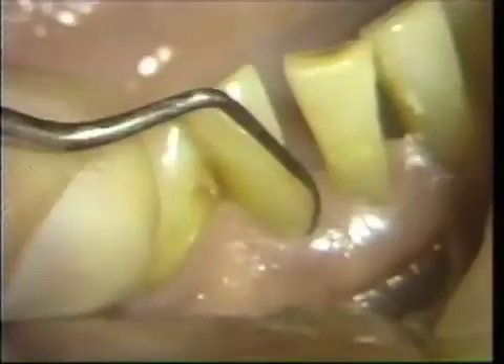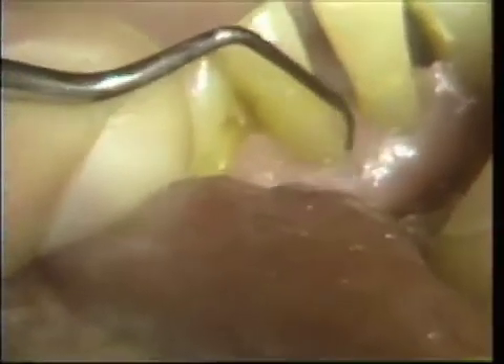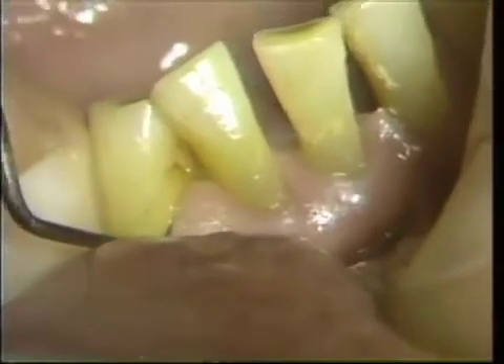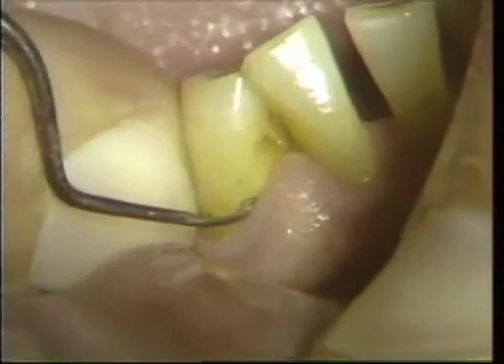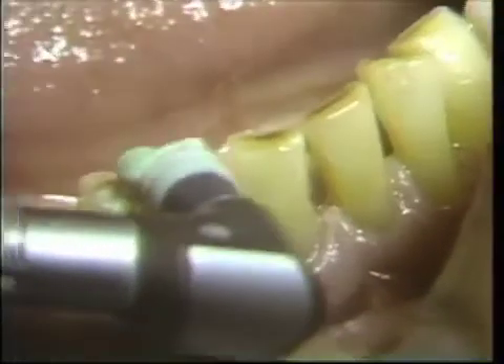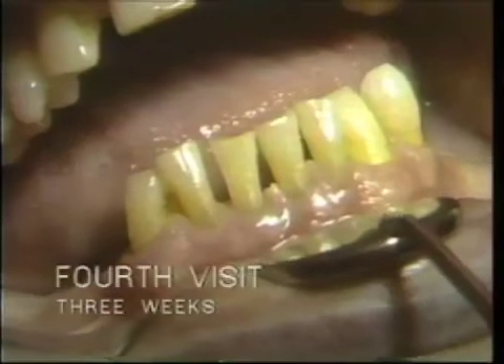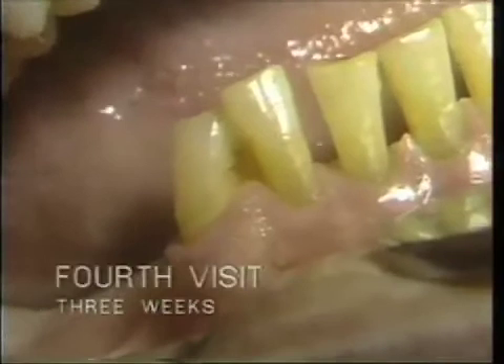Subgingival calculus is identified and addressed on teeth 27, 28, 29, 30, 31, and 32. This represents three weeks after the scaling on the left side and two weeks on the right side.